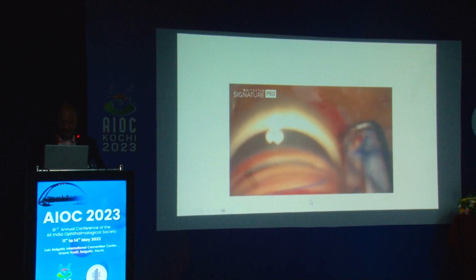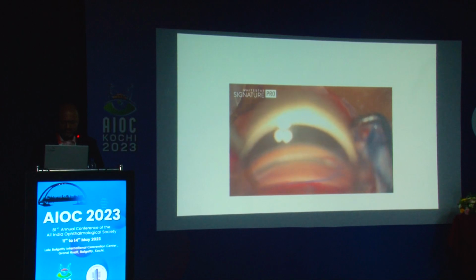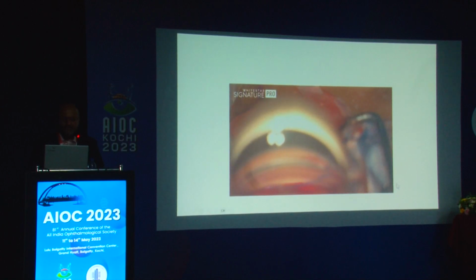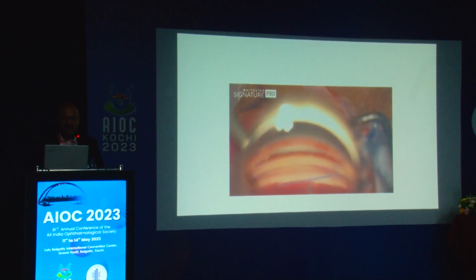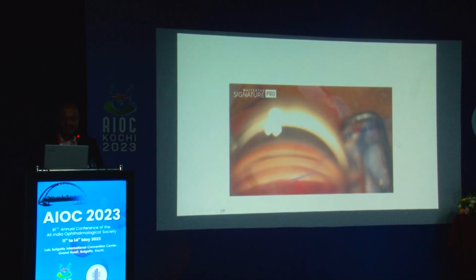Oops, I think the view isn't very good. So this, because of the peribulbar block, the subtenon block, the chemosis was so severe that the patient had a severe regurgitation of blood from the Schlemm's canal.